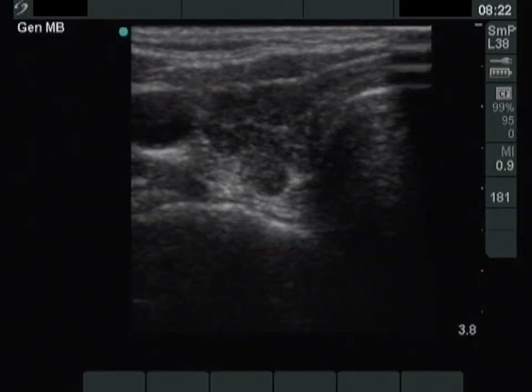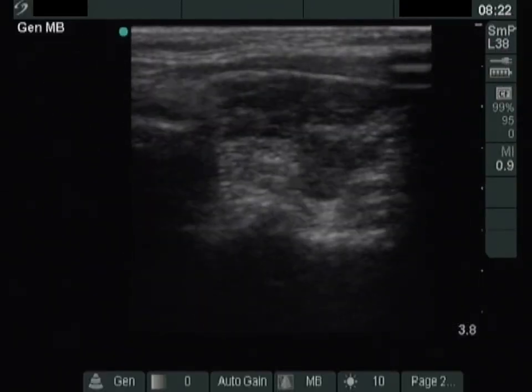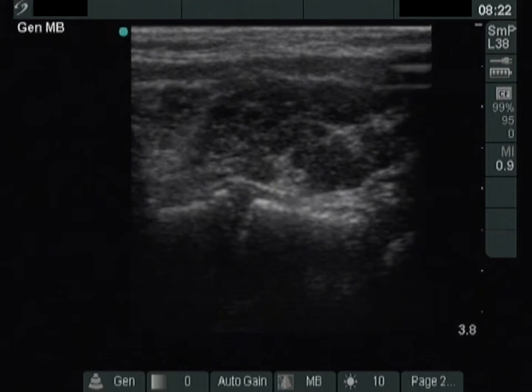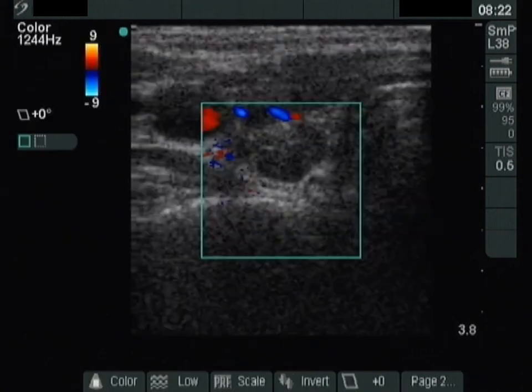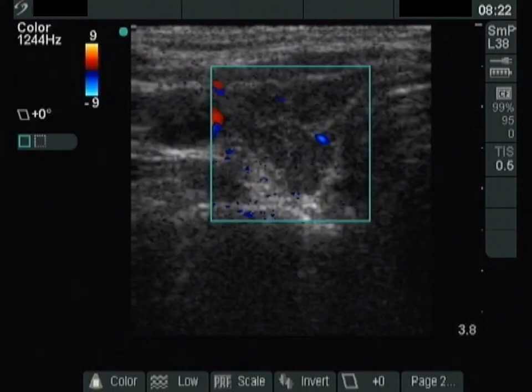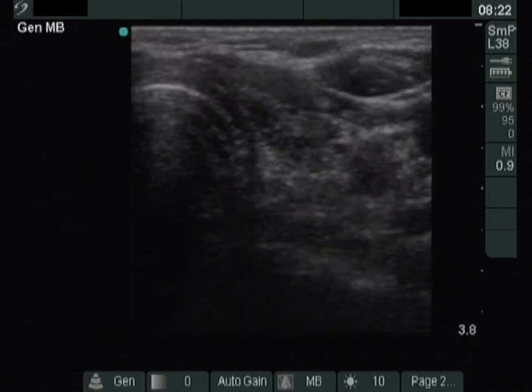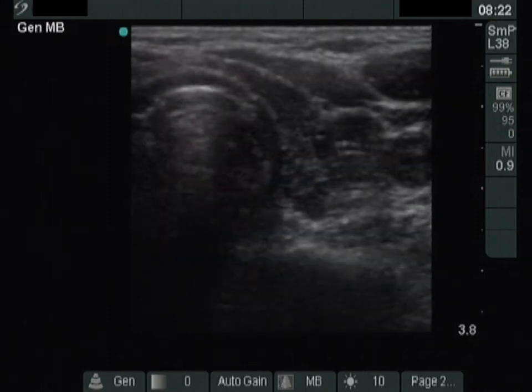In the video first, the right lobe is presented. This is a typical sonographic pattern of Hashimoto's thyroiditis — a hypoechoic lobe with fibrotic changes.